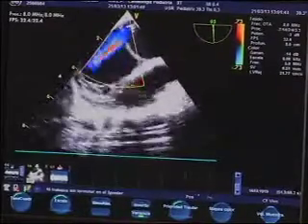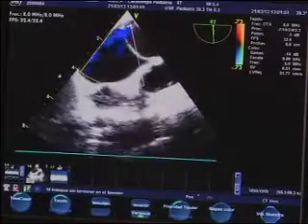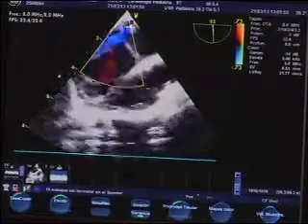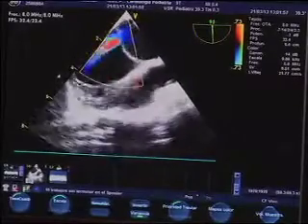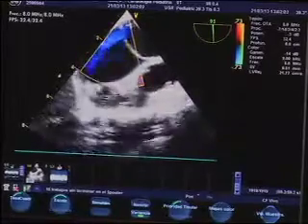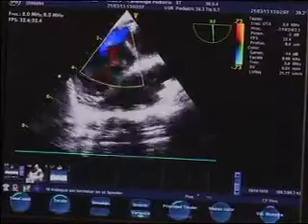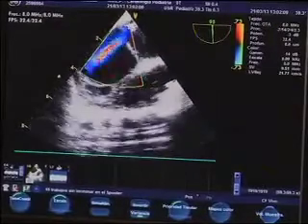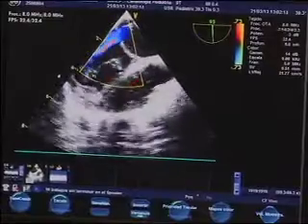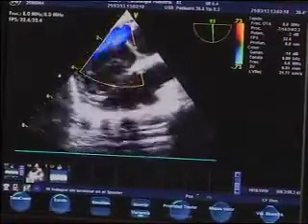So the other problem here is that this hole is pretty close. It's only 10 millimeters away from the tricuspid valve. So I was ready not to stent there because I think it's too close to the tricuspid valve. And my idea was to go up to make another hole with a transseptal puncture up from this ASD.